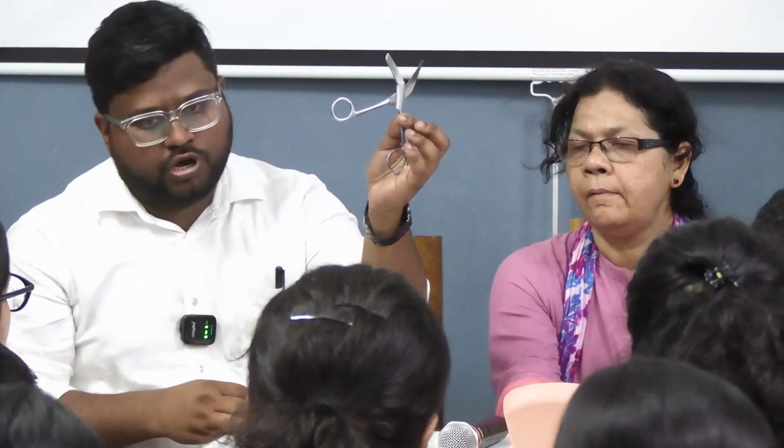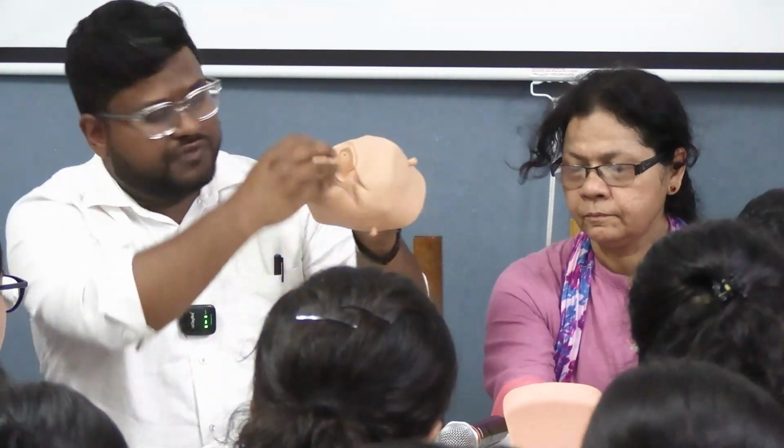This is known as an episiotomy scissor. It has been taught once. It has two different kinds of blades, one sharp blade and one blunt blade. Okay. When your fetal presenting part is stretching this perineum, this is a lax perineum, at such a time we will not give an episiotomy. We give it when the fetal head is stretching the perineum. Why? Because at that point the layers are stretched out, so we are going to injure less, okay?